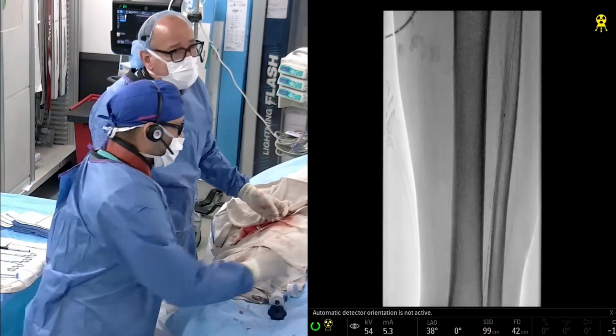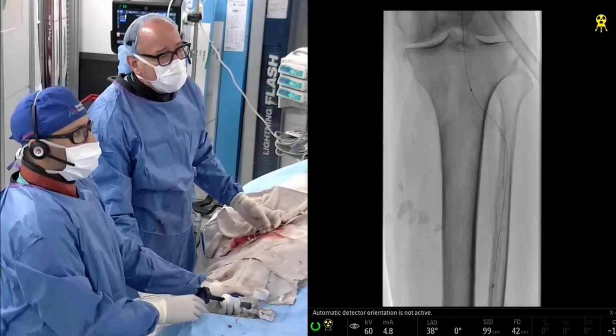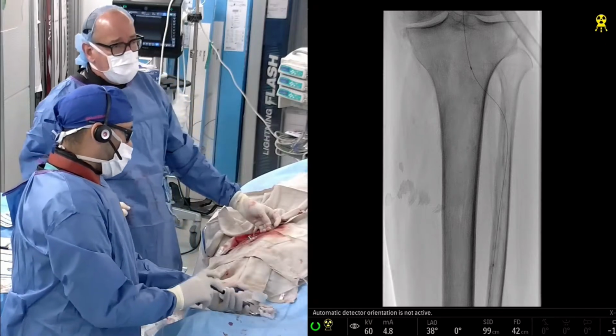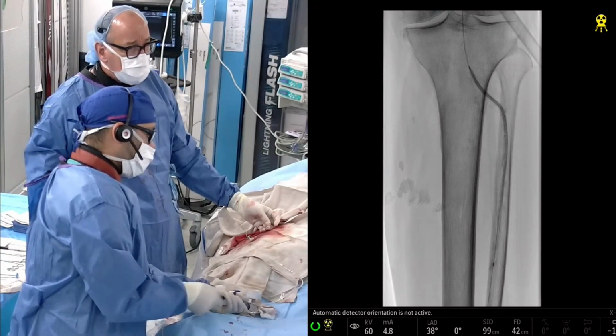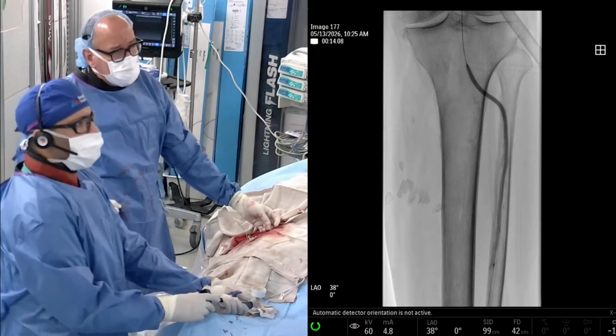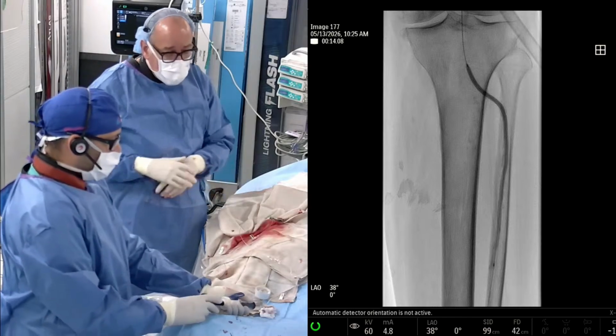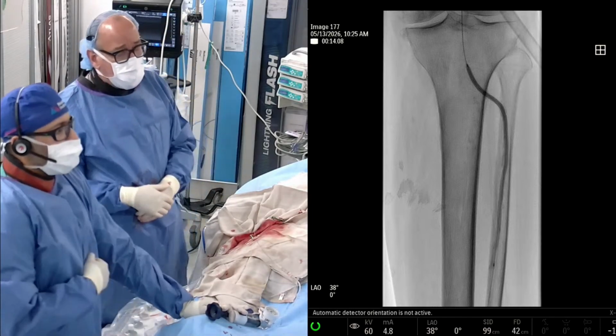Let's take this up. And here we are bridging all the way into P3 almost. So again, same inflation. And this looks like a great 14. Yeah, semi-compliant balloon, excellent. Right now? Yeah, this is a semi-compliant balloon. The specific balloon is the Coyote balloon.